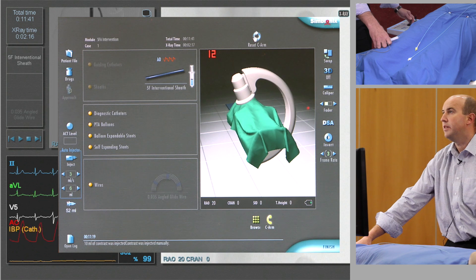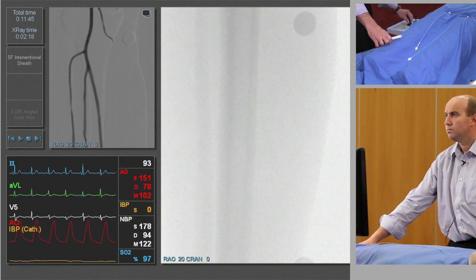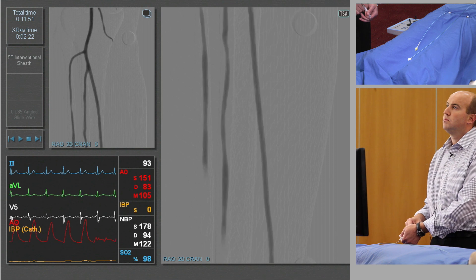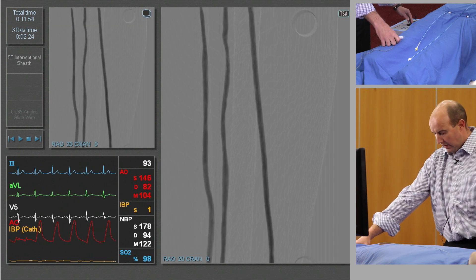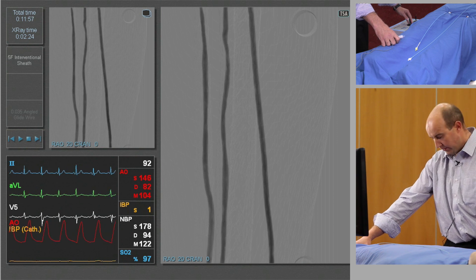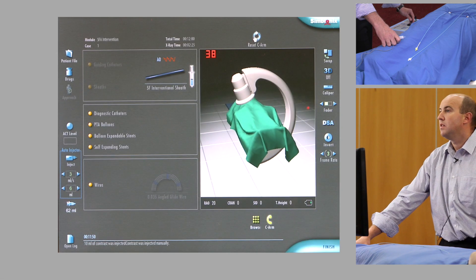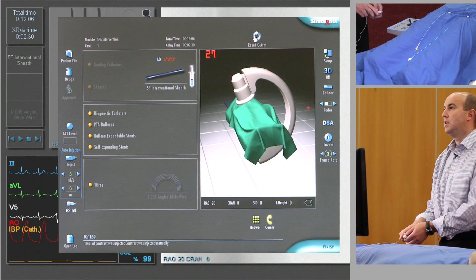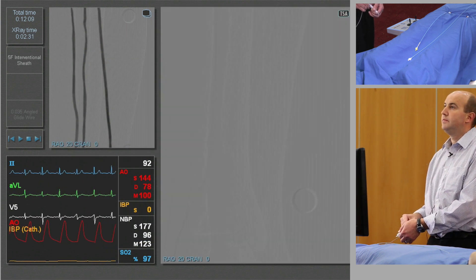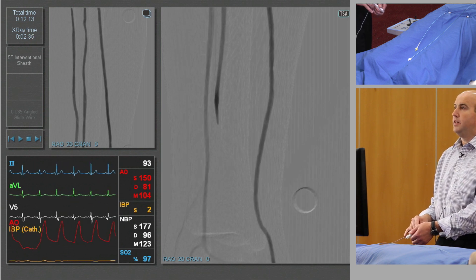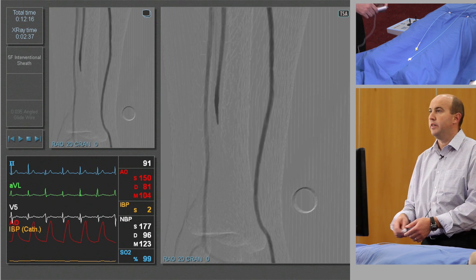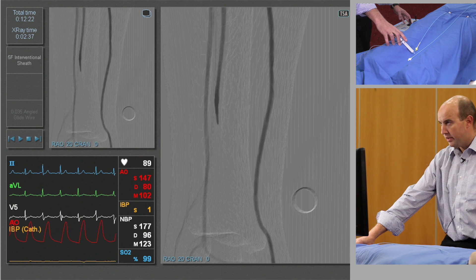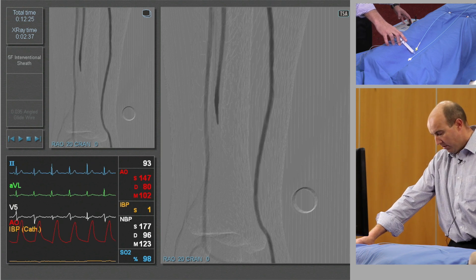We'll just center up on the tibial vessels. Very good — and down as far as we can get, usually to the ankle joint, to the mortise joint. We do a DSA run: the distal peroneal peters out, but nothing we're going to treat. We can see a good anterior tibial and a posterior tibial vessel crossing the ankle. So we know at this stage that the disease we're going to treat is that isolated proximal SFA segment.